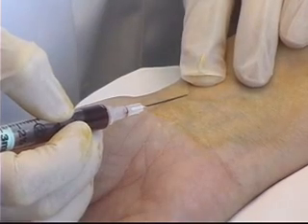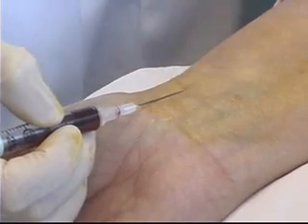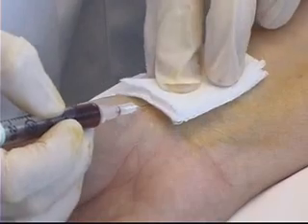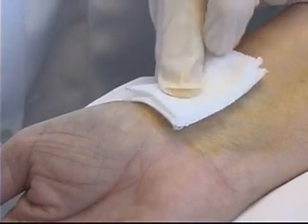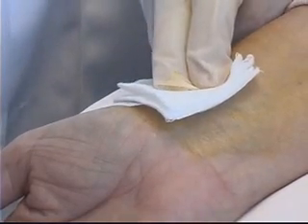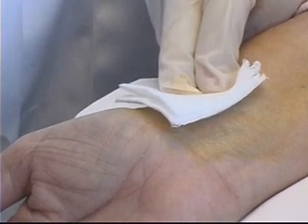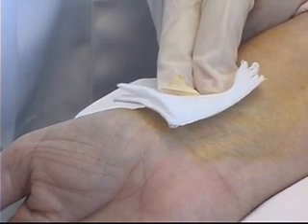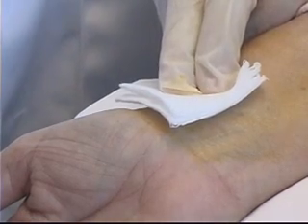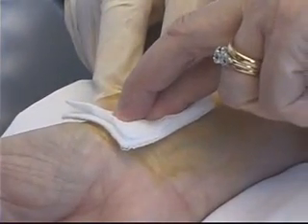Once I've obtained an adequate blood sample of 1.5 to 2cc, I'm going to cover the area with my 2x2 gauze and very quickly pull the needle out of the skin. I can then apply pressure to the area for approximately 5 minutes — or double that to 10 minutes if the patient is on anticoagulant therapy. If my patient is cooperative, I can ask her to apply pressure over that area until I return.